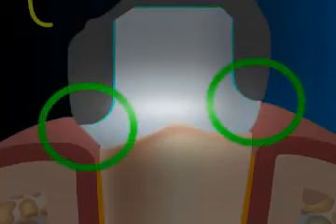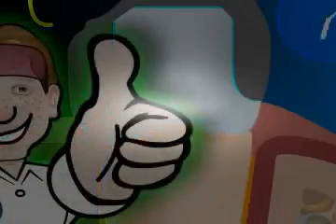The adhesive can flow easily in the cementing process, which allows for a thin joint. The technician has enough room for the ceramic, the edges are tightly closed, and food particles can't get caught. To achieve a round margin abrasion, the work must be done under magnification, and also when the impression is made, particular criteria must be observed. Although this technique requires a lot of complicated work, in return you get your tight-fitting crown.